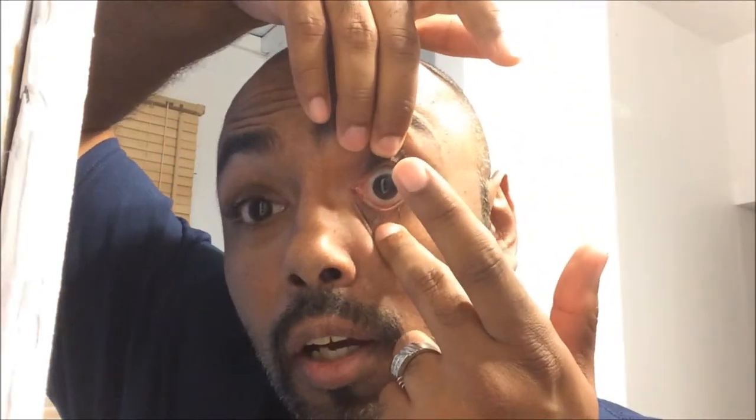I actually still have my contacts in, so I'll show you how I take them off and put them back on. Basically, I have the contact on my pointer finger, and then I use my middle finger to hold the bottom down, and then I use my opposite hand to hold the upper eye up. So you see full access to my eye.